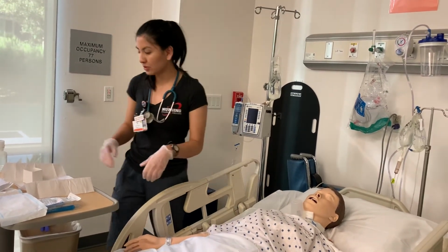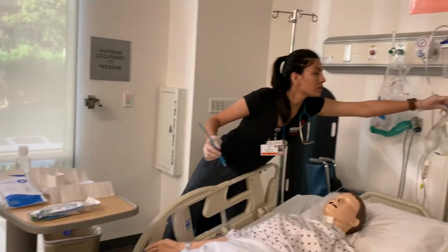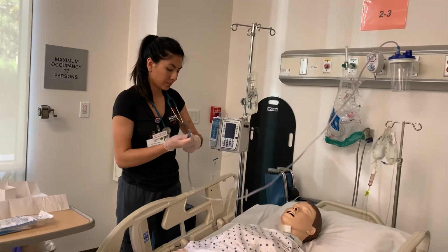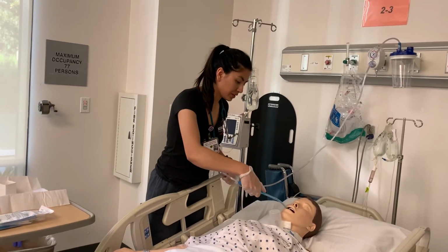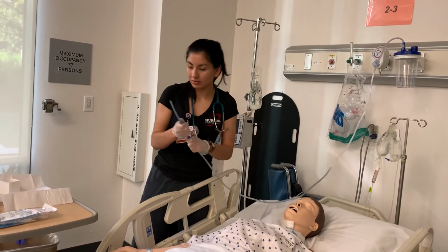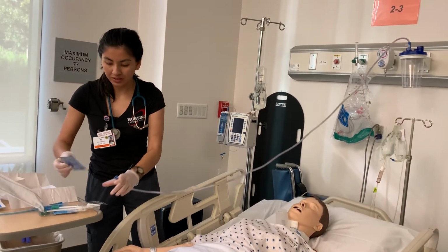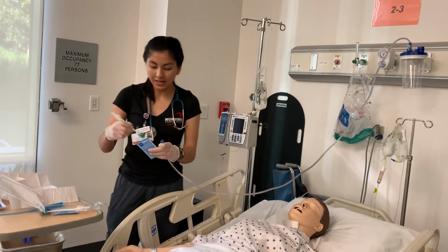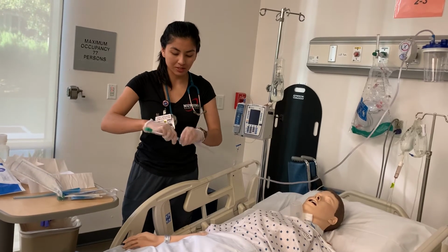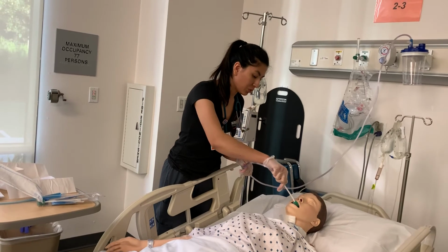But I'm also going to do some oral care, so I'm going to hook up the suction to the Yankauer, or however that's pronounced. And then I'm going to go ahead and suction her mouth. And then once that looks good, I'm going to disconnect this. And I'm going to get my oral care suction kit. I'm going to get the mouth rinse and then dip this gauze suction into it. Attach it to my suction. And I'm going to continue oral care.